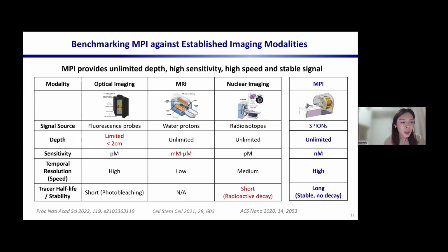MPI effectively bridges these gaps. It offers the combination of deep tissue penetration, high sensitivity, and zero radiation. This makes it ideal for a lot of applications.